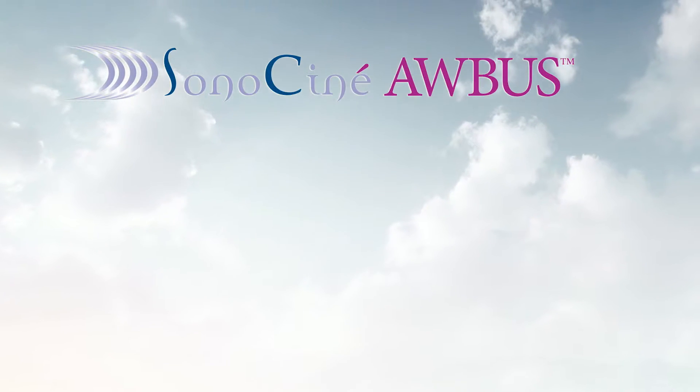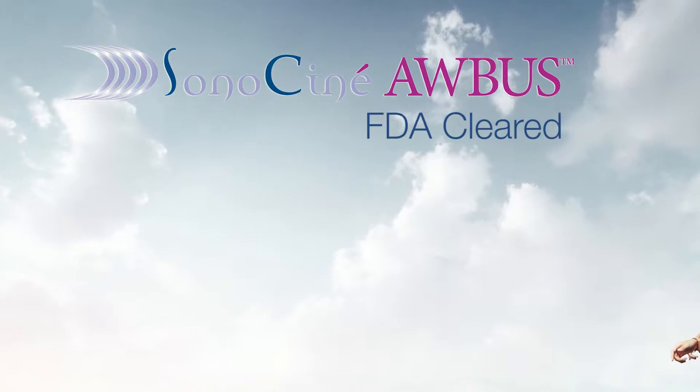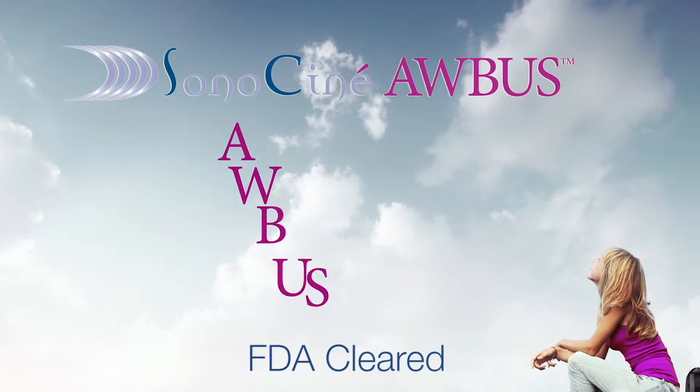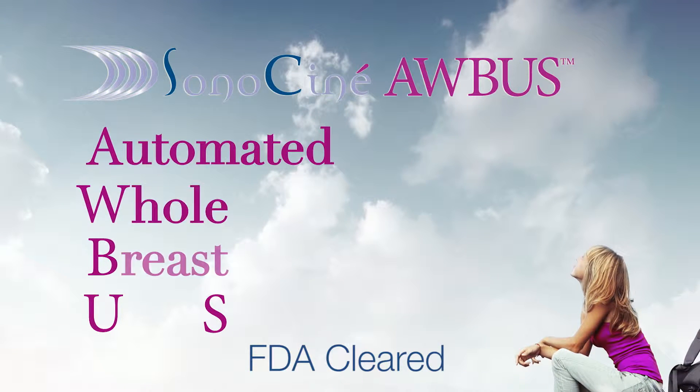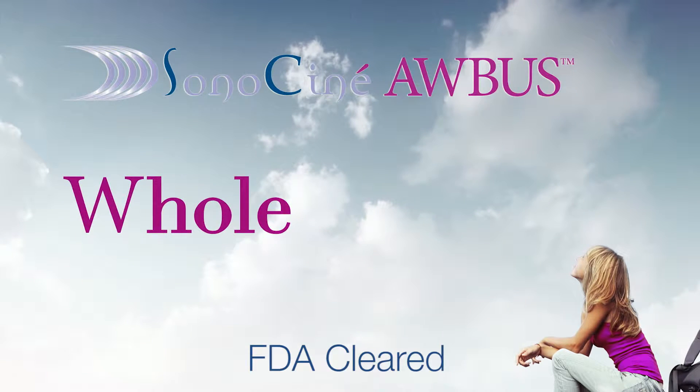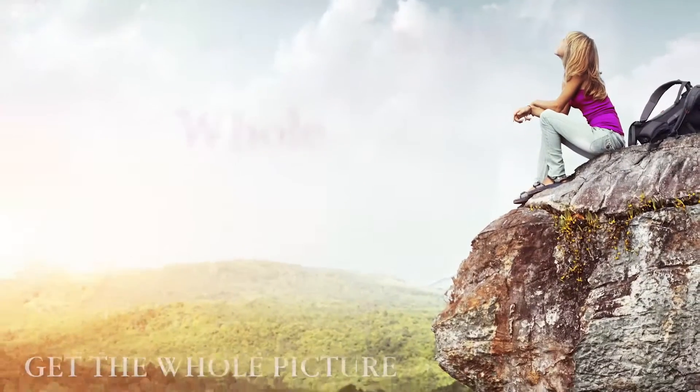This is the SonoCiné AWBUS examination, an FDA-cleared supplementary examination to your screening mammogram. AWBUS stands for Automated Whole Breast Ultrasound, and we at SonoCiné AWBUS are very proud of that W because unlike other technologies, SonoCiné AWBUS gets the whole picture.